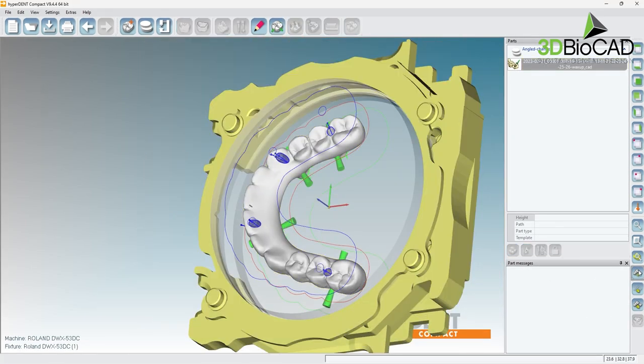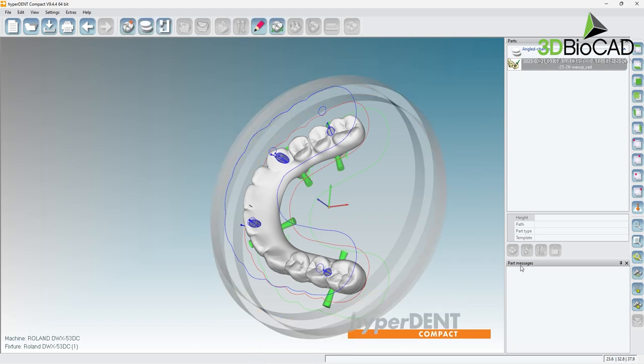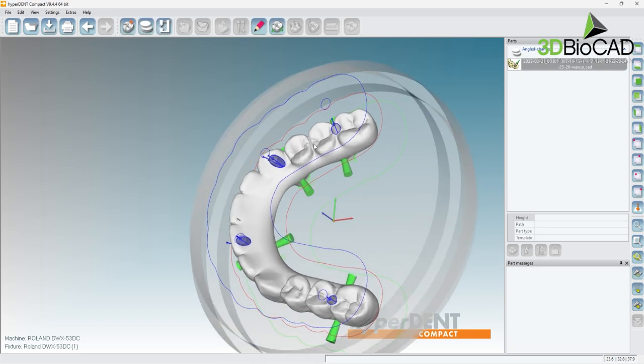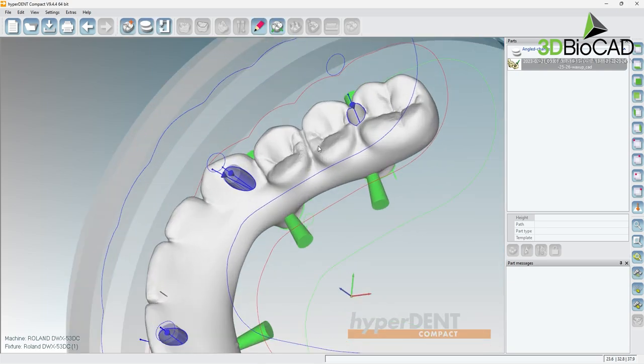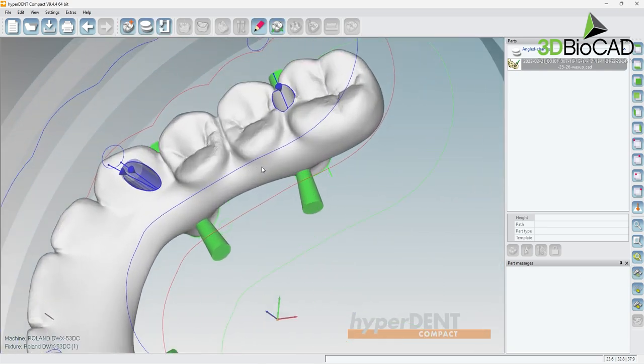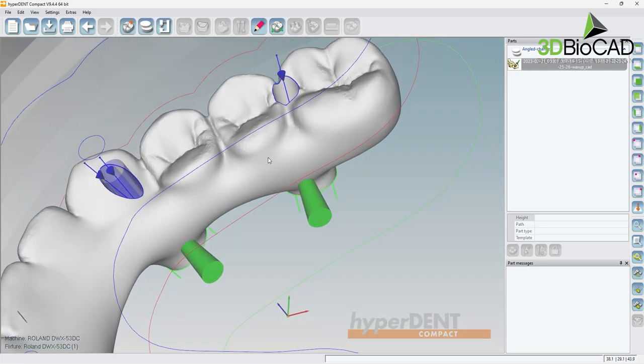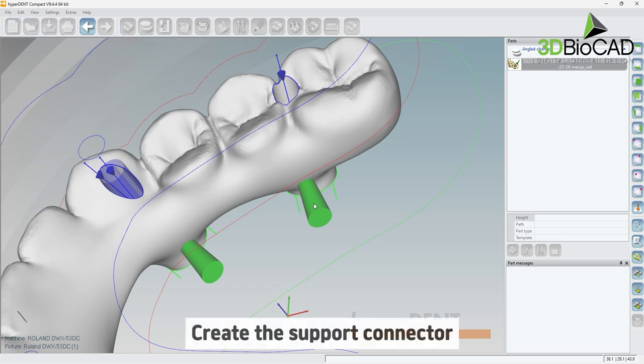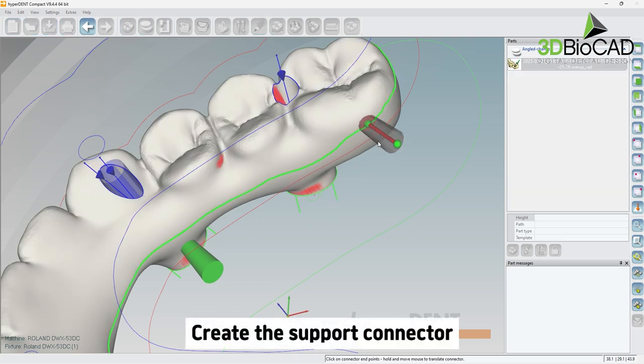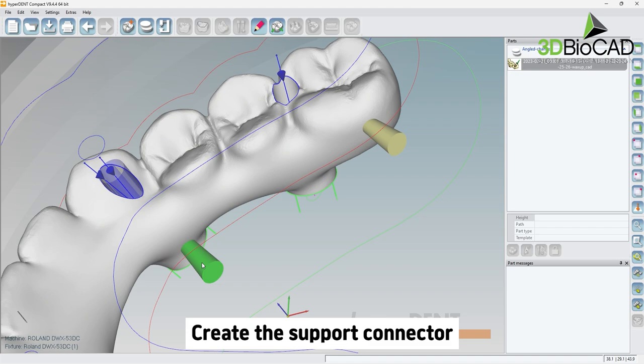Now we have to add connectors. First, let's turn off the view of the fixture by highlighting the fixture and selecting the hide selected tool. Now we can move the pins to the desired locations. Connectors are generated automatically when placed in the blank.